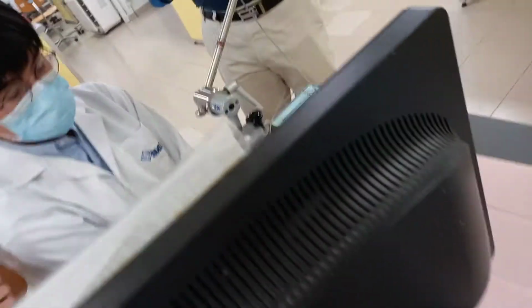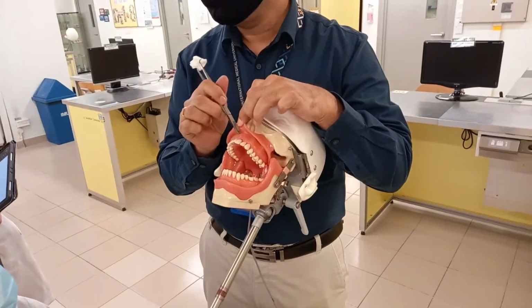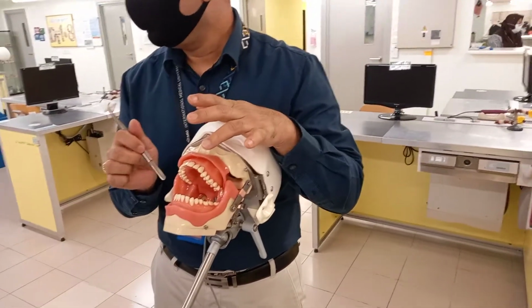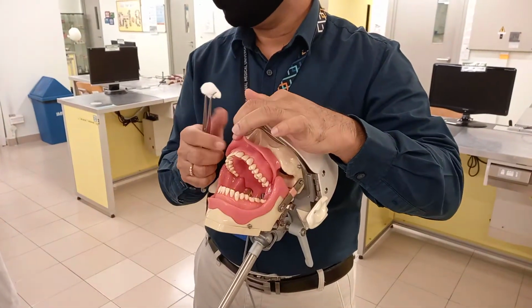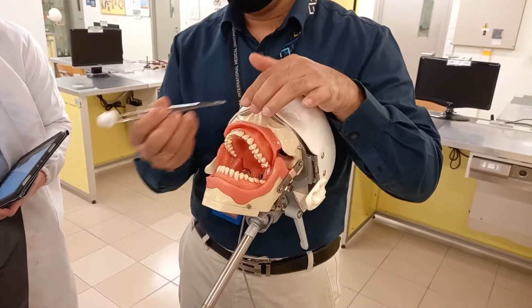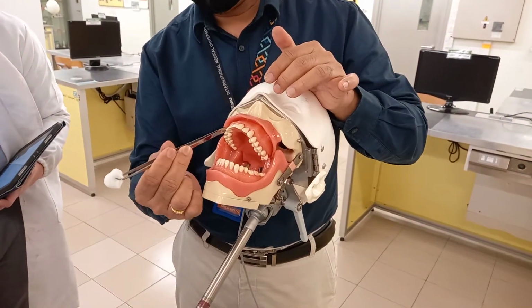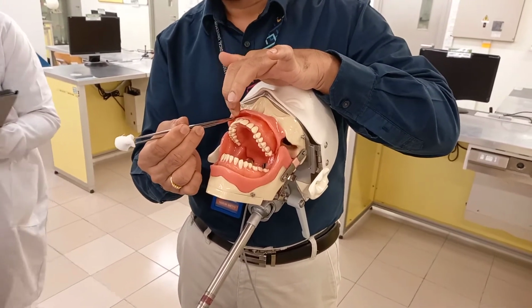Okay. So if you pull the patient's lip too much like that, this becomes straight. You can't feel the mucobuccal fold. You should just pull a bit like that. Don't make it straight, because if you make it straight, then your needle will come out. Make sure if it's a premolar, for example, you are in the mucobuccal fold. This depression. This depression.